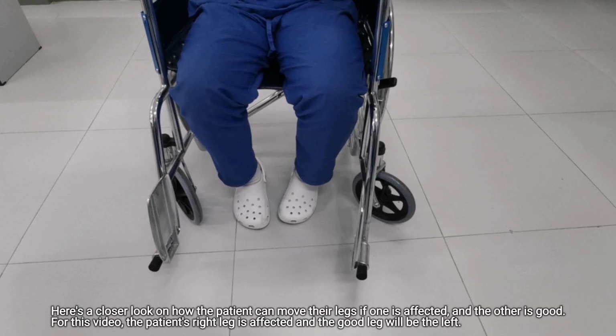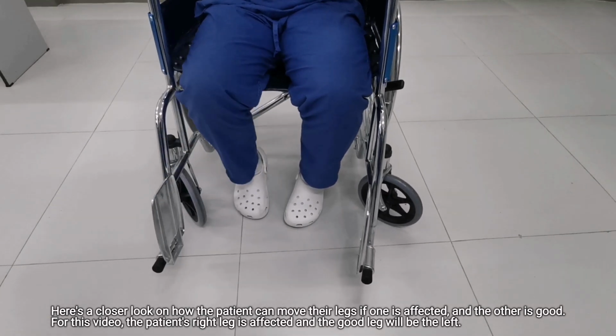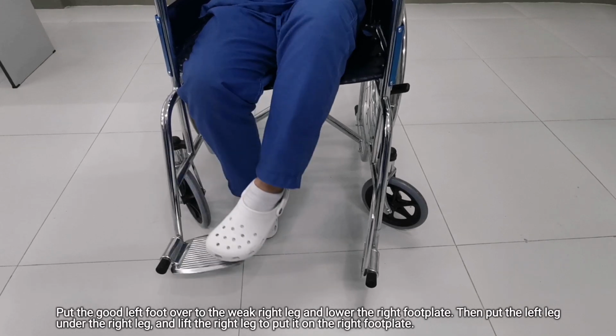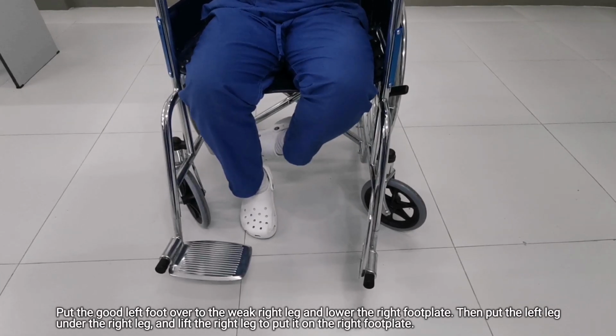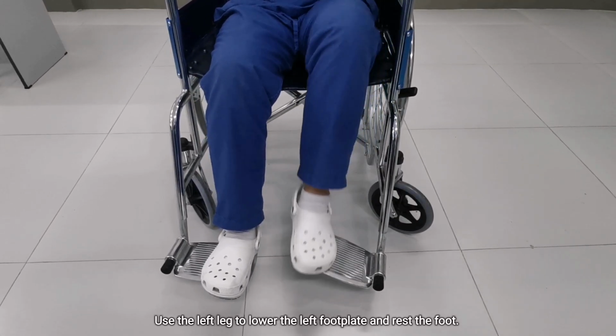Here's a closer look on how the patient can move their legs if one is affected and the other is good. For this video, the patient's right leg is affected and the good leg will be the left. Put the good left foot over the weak right leg and lower the right foot plate. Then put the left leg under the right leg and lift the right leg to put it on the right foot plate. Use the left leg to lower the left foot plate and rest the foot.